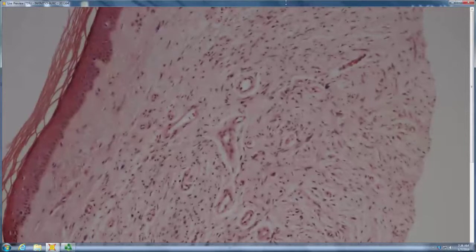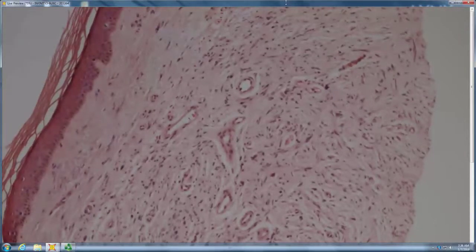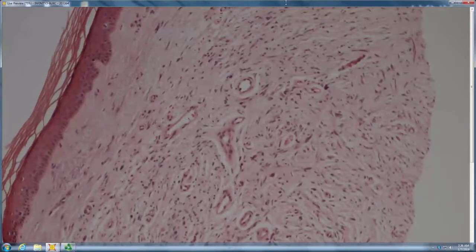You can have that in the nerve cells. I think it's more mitoses. Exactly, so you are absolutely correct. Atypia alone in neural crest or smooth muscle neoplasms means nothing; mitoses do mean something.